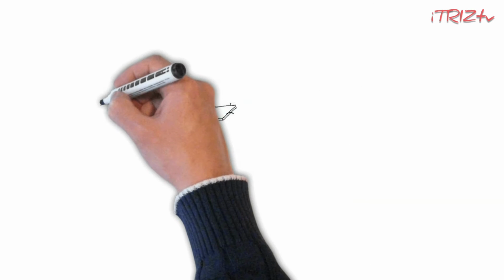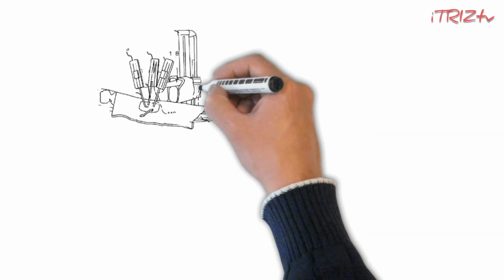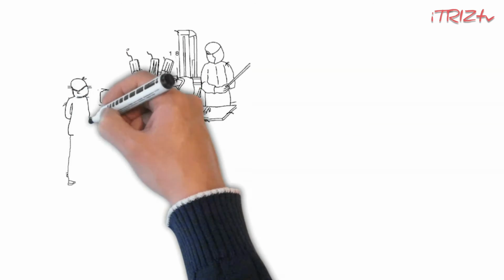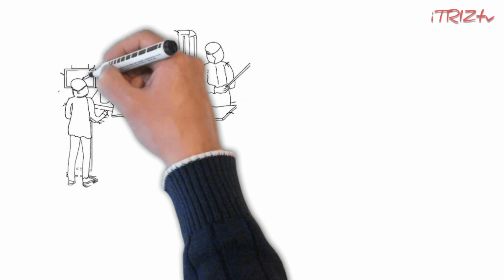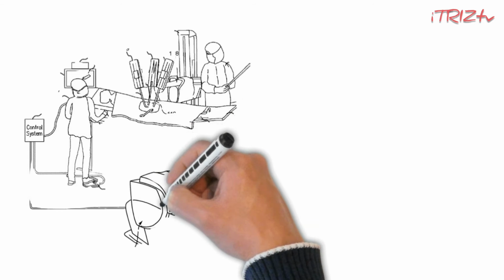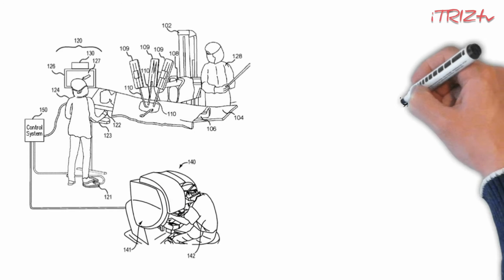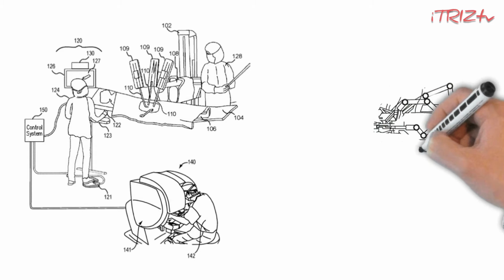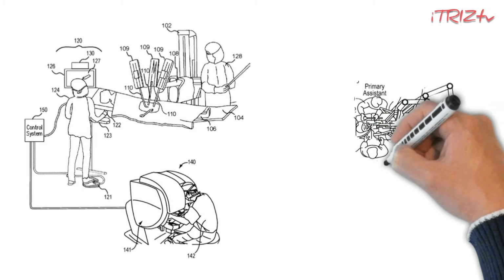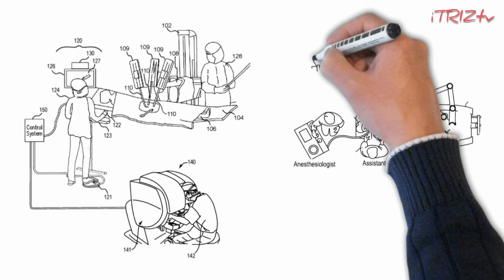Complex robotic operations are carried out by a group of doctors. The main surgeon works behind the control panel of the Da Vinci robotic system. 2 assistants near the operation table observe the work of the robotic hands and replace the instruments handed over to them by a nurse. Also, an anesthesiologist remains near the patient the whole time of the operation, controlling his or her sleep.